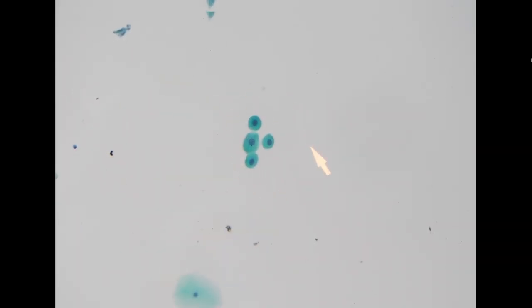So for the normal urine cytology, usually we will see some urothelial cells, and these cells look more like intermediate cells. And sometimes, if we are able to identify some umbrella cells, usually the cells are much bigger, maintain a low NC ratio, and sometimes with multinucleation, such as this one. So this one looks more like a normal umbrella cell. So we have some intermediate cells and umbrella cells.